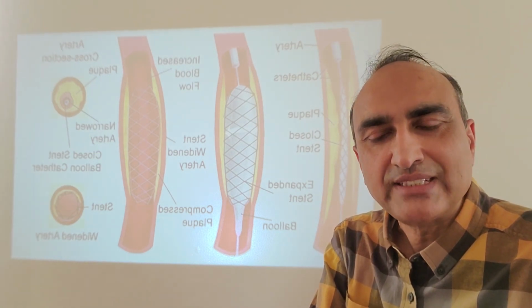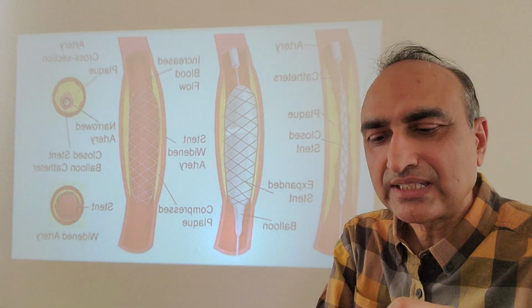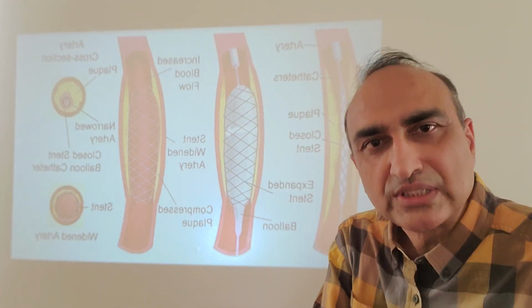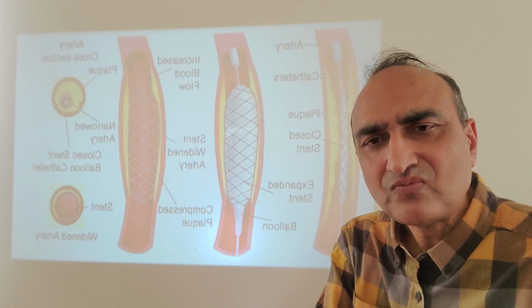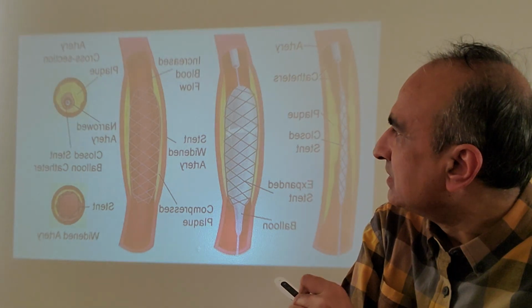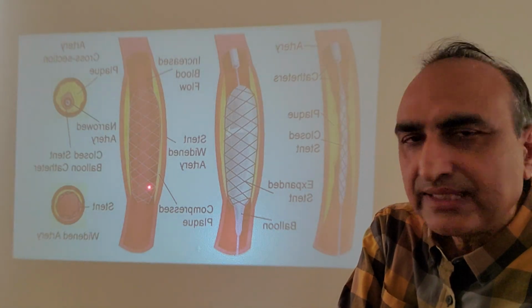The amazing thing is most diabetic people do have small vessels as well. Unfortunately, that's not a very pleasant situation. If you have a small vessel and diffuse disease, then certainly we have an issue treating those vessels effectively with the stents.